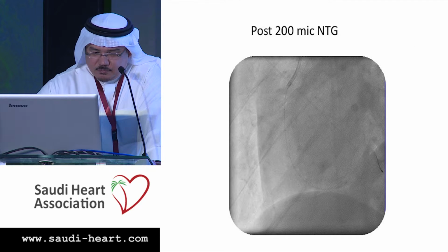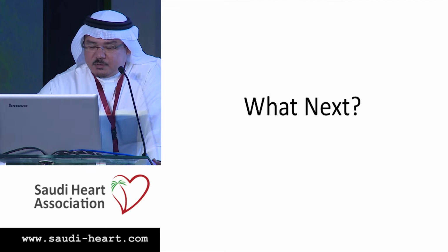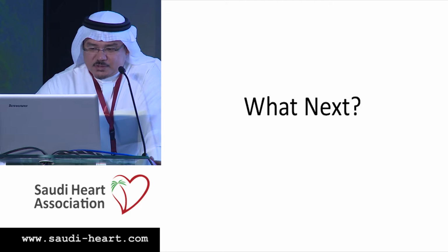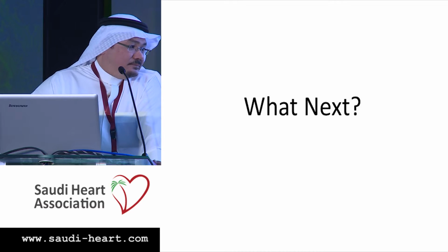I gave nitro. It did not help much. I stayed there. What should I do? Should I send the patient to the CCU with heparin and a 2B3A blocker, or should I proceed with reinflating another balloon or stenting?